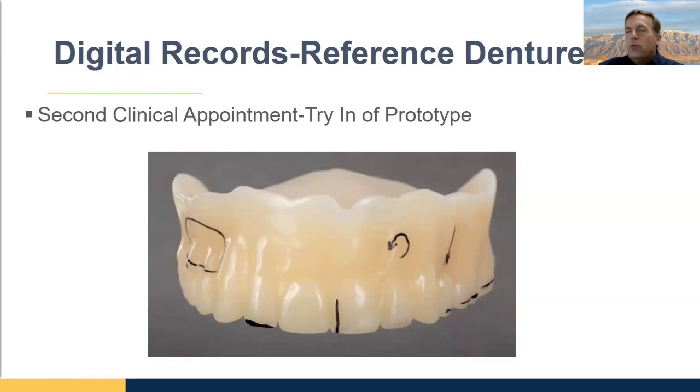Some people do post-dams that are very similar to the butterfly shape like they do for an analog denture. Some people don't do them at all. So you'll need to decide. My thought would be very minimal because the point of this whole process is to get really good adaptation. So I would probably put a little bit just to be on the safe side because you can always trim it if you need to, but I wouldn't do the huge, almost a millimeter butterfly that you usually do, maybe half a millimeter, something like that.